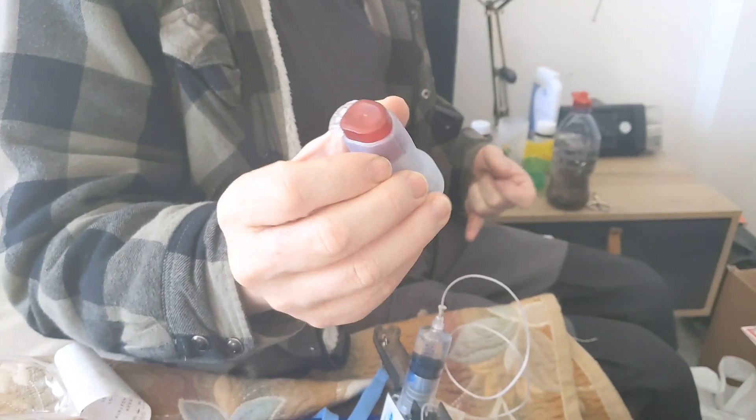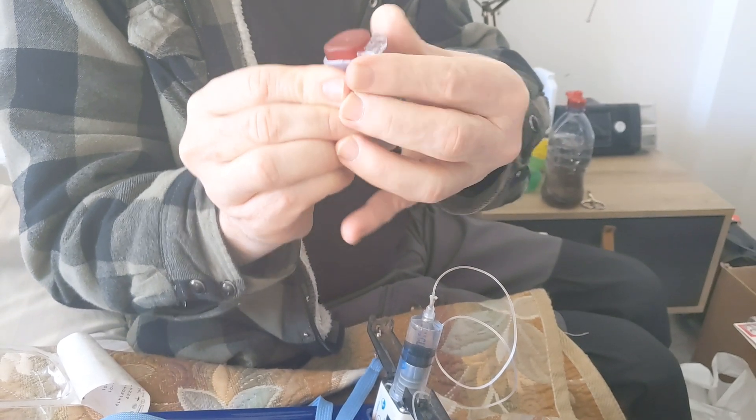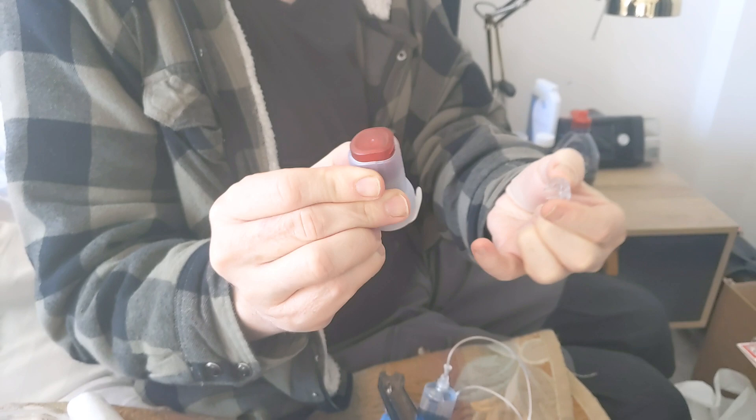Now for the cannula — first we have to remove the lock by squeezing it and pulling it out.